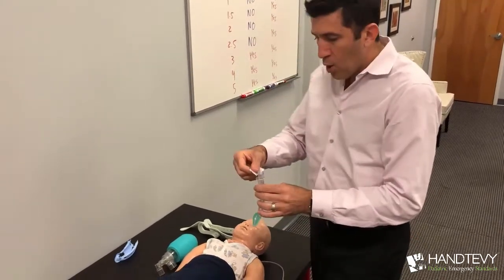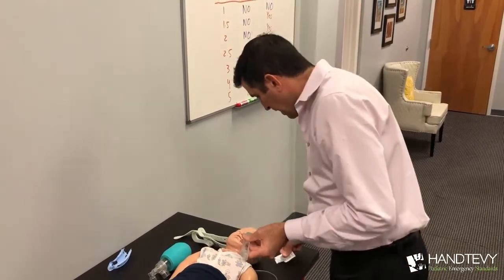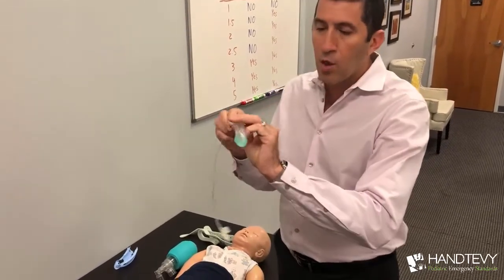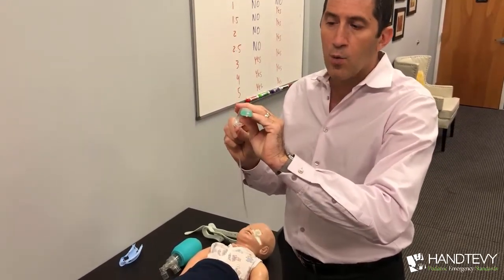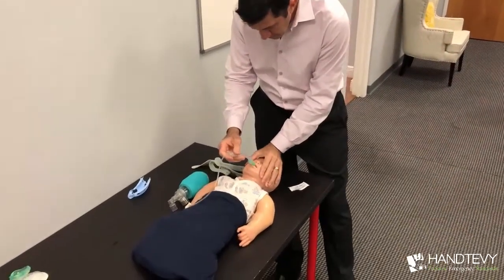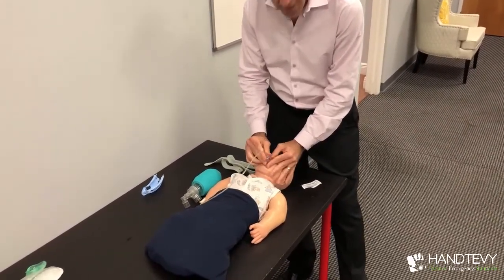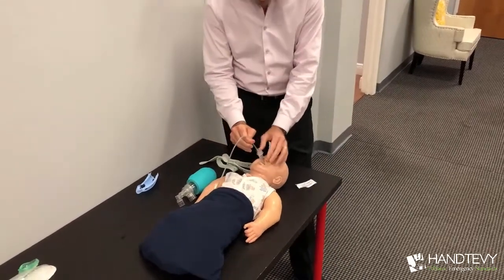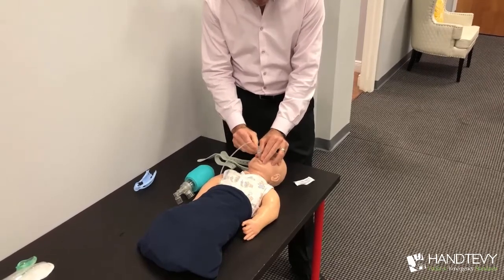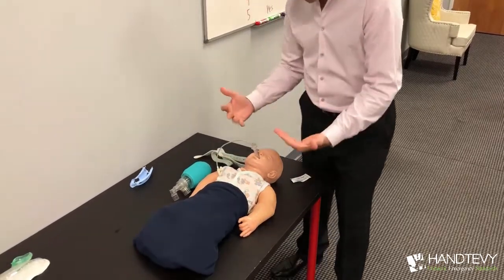Let's look at how we put the 1.5 into this child mannequin. We're going to put lube over the port, and we're going to put lube over the i-gel itself. Then we take the Salem sump — go all the way through it first so you know it gets through — then go right back to flush. Now we're going to insert it into the mannequin. It just inserts straight down until you meet resistance. At that point, you push the tube all the way down to the desired length — all the way down until it reaches the exact length we've measured.